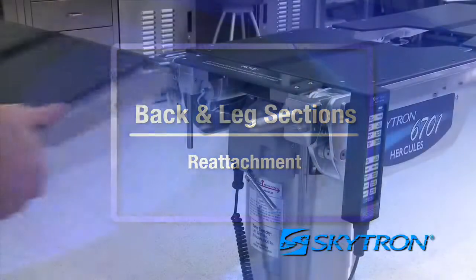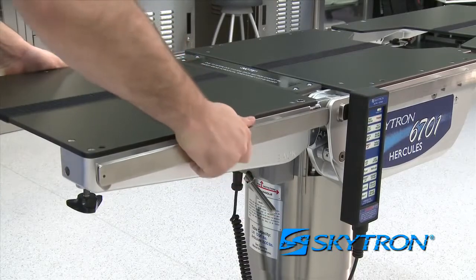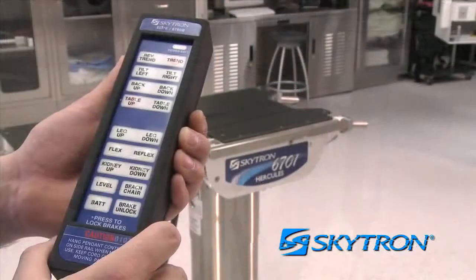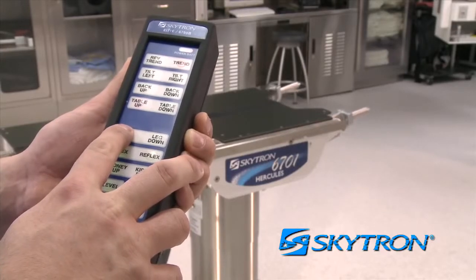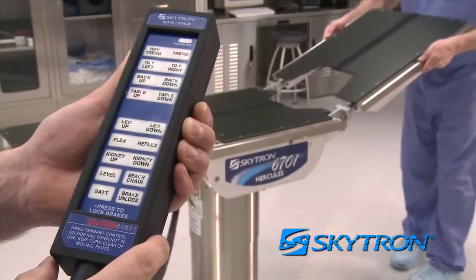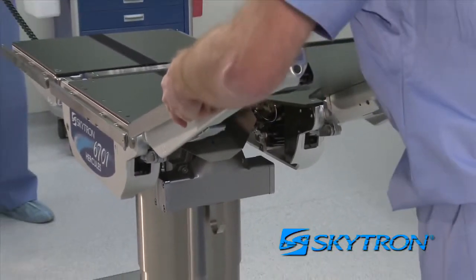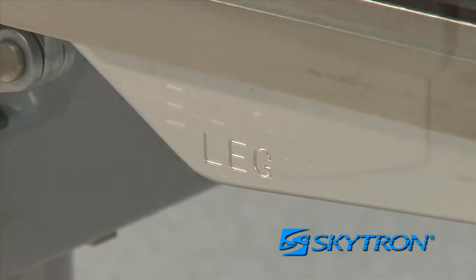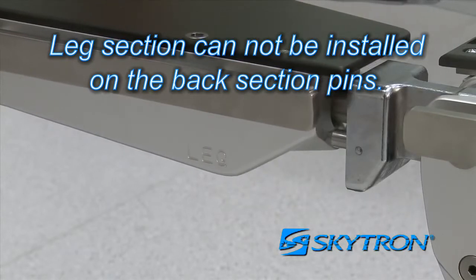To replace the back section, slide it back onto the pins until an audible click is detected from both pins, then pull back to be sure it is positively locked onto the table. To replace the leg section, press the leg up button on the pendant control and raise the pins to their highest position, then slide the leg section onto the pins until an audible click is detected from both pins. Pull back on the leg section to confirm it is positively locked. Leg and back sections are labeled for proper orientation; the leg section cannot be installed on the back section pins.